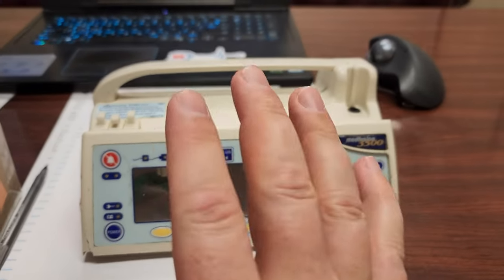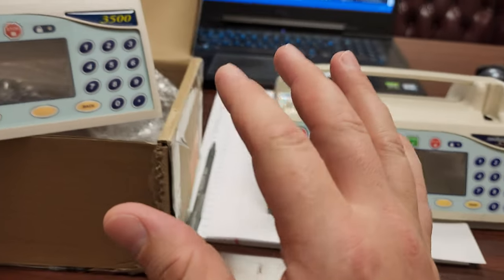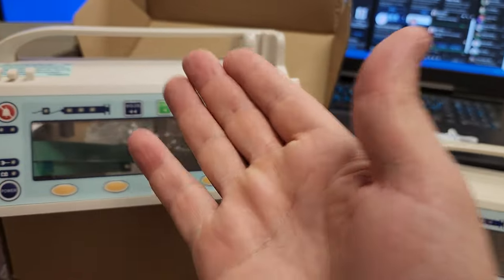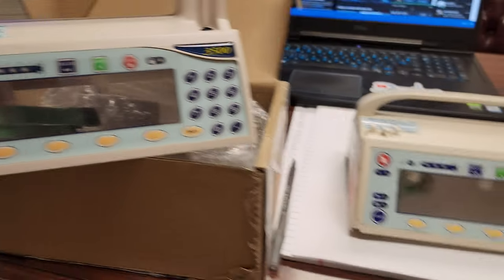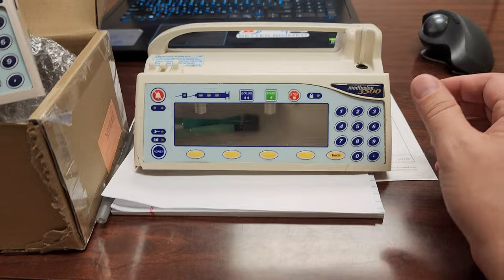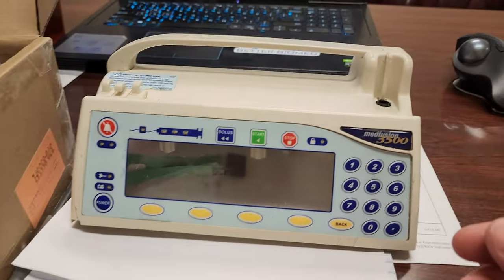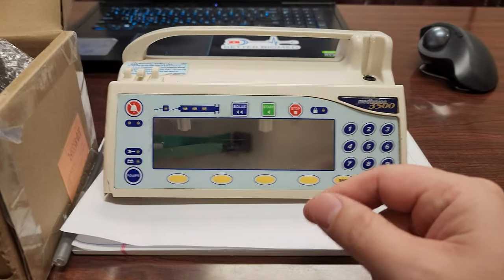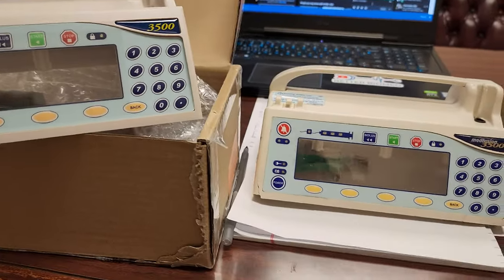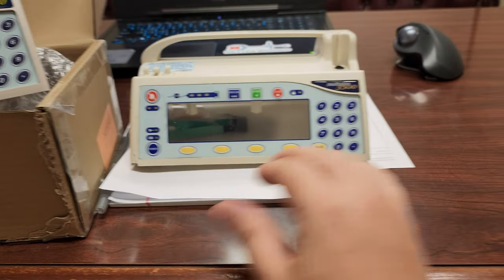I just wanted to do a quick video to show you guys a comparison and how far along we really are when it comes to OEM products versus third-party products. This is one of the arguments they're making for right to repair — that we can't produce a product as good as the OEM product — but that's not true. Modern manufacturing has caught up and this is a very good example.